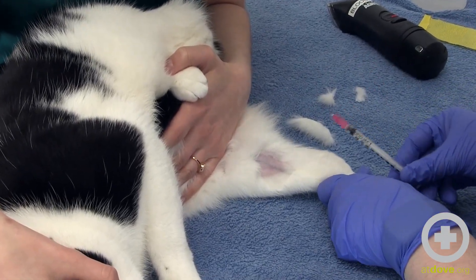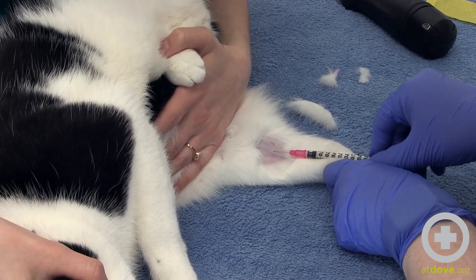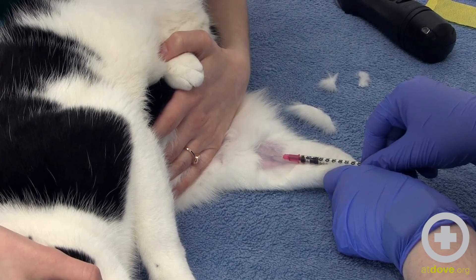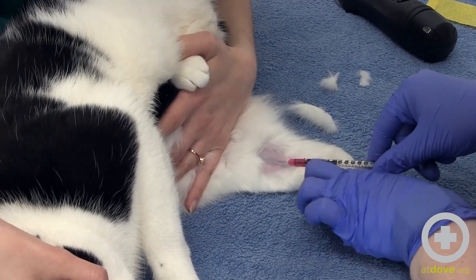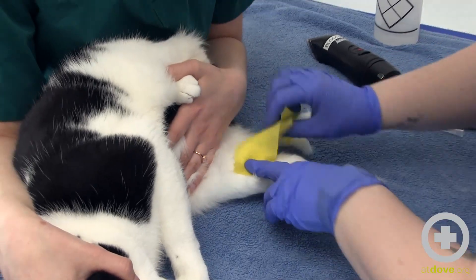And then with my bevel up, I am going to put the needle directly into the vein and draw back. That's about all we need for our PCV. So we are going to hold off and wrap the leg.